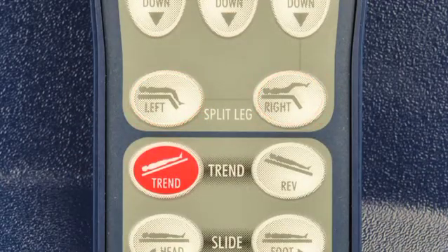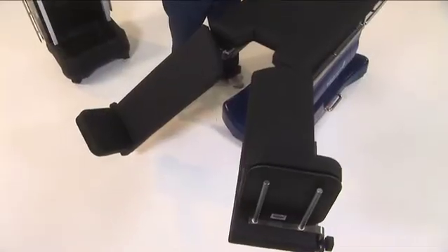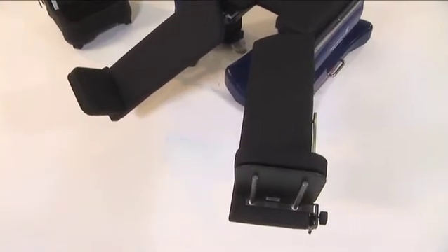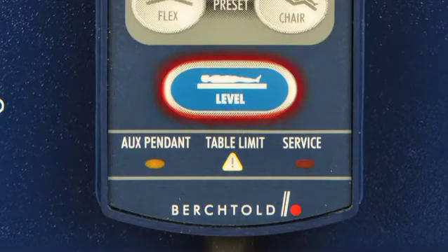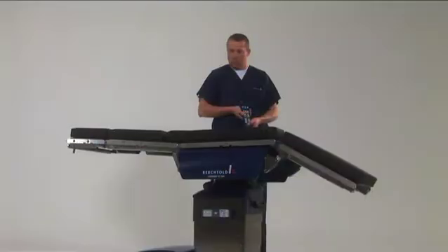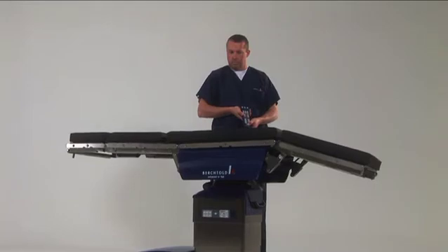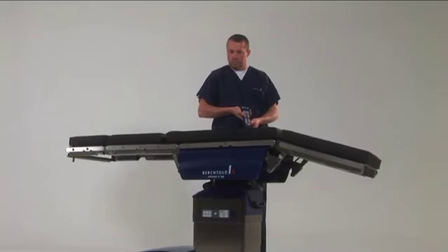You can now use the split leg keys on the table hand pendant to raise or lower each leg as needed. Press the level button and the table will run through a pre-programmed series of anatomically correct adjustments until the table is once again level.